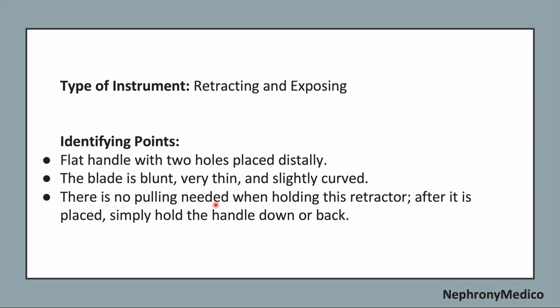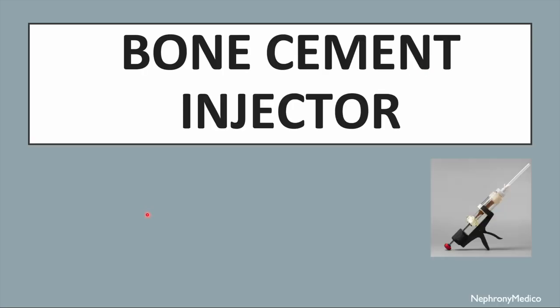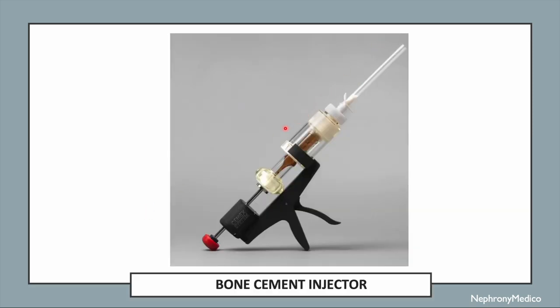There is no pulling needed when holding this retractor. After it is placed, simply hold the handle down or back. Use: it is used for retracting a small amount of the tissue in a very tight area. Let's talk about bone cement injector. This is a picture showing a modern type of bone cement injector.